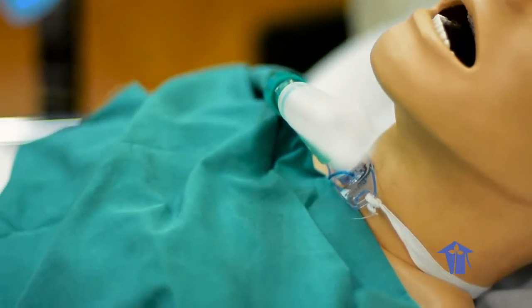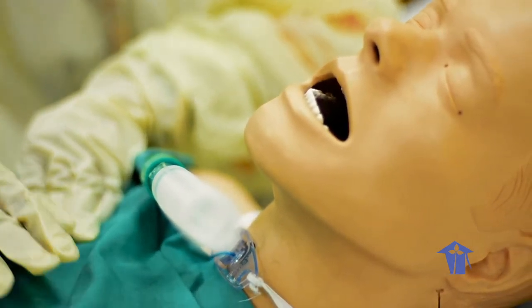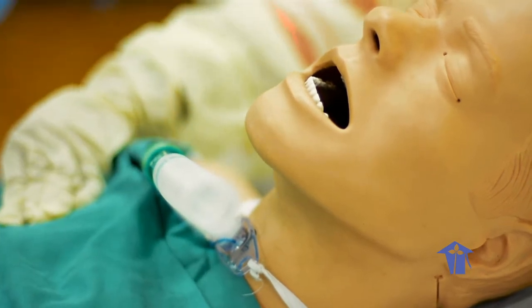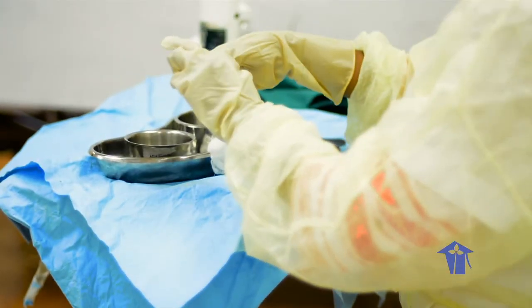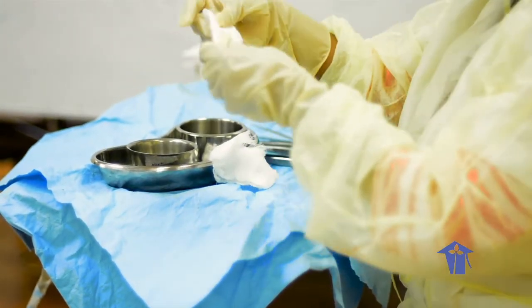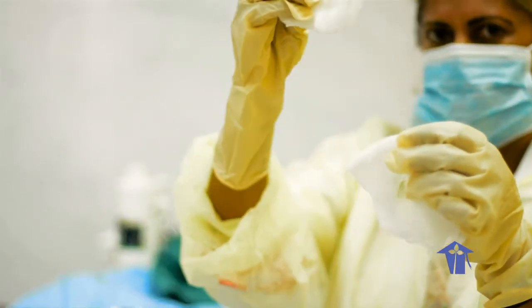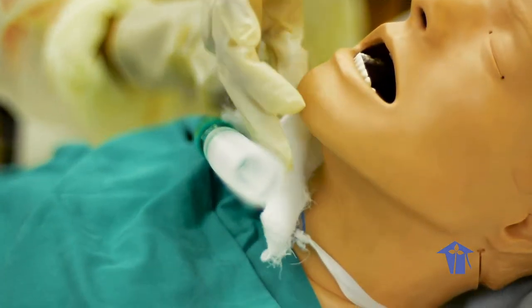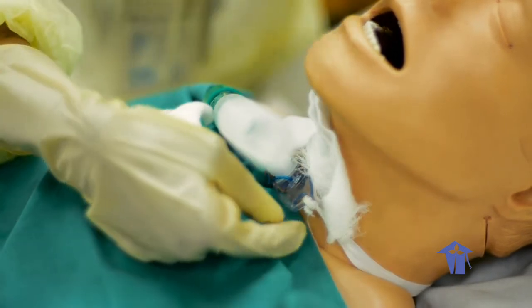During this time, we can speak to our patient, making sure they are comfortable and not in any pain. I see that you're not closing your eye tightly, so that means that you're comfortable. You would slide the commercially prepared tracheostomy dressing. If you do not have a prepared one or a tracheostomy kit, you can take a piece of gauze, use a sterile blade and cut it downwards, so you will have a half opening. You would then place it under the faceplate.